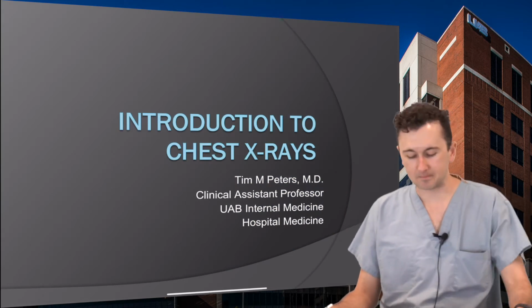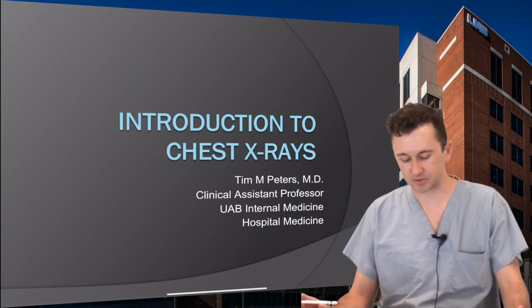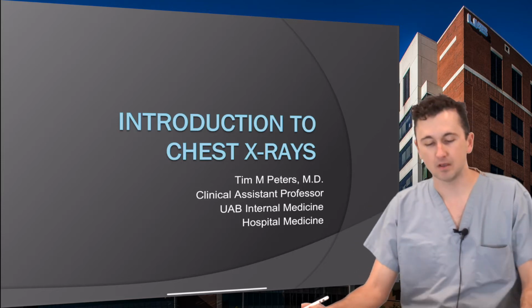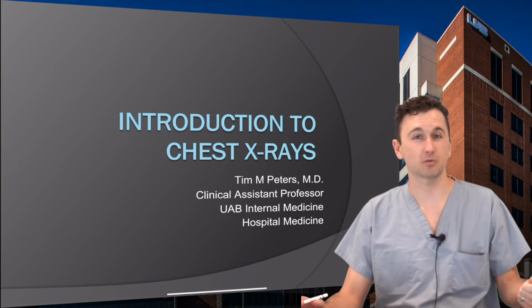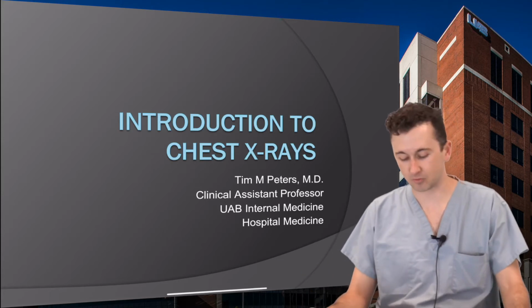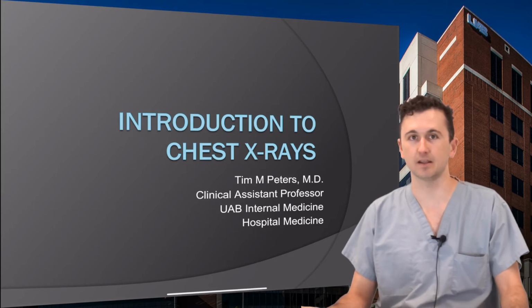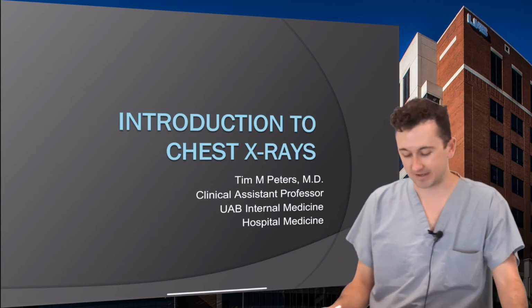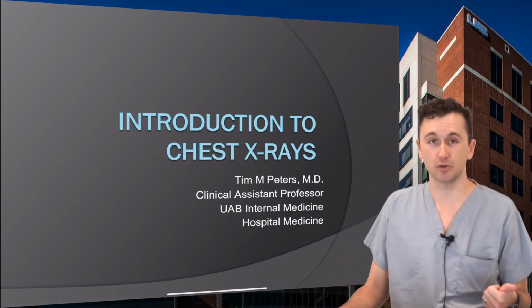So at this stage in your career, there are really just a few things that I want y'all to be able to do as you're coming back into your clinical years. One, I want you to be able to use the right language when you're describing a chest x-ray, because really the number one job of being a third-year med student is to not sound like an idiot, which is going to happen every day. But if you can at least use the right words, you can mask that for a little bit longer. So use the right language.